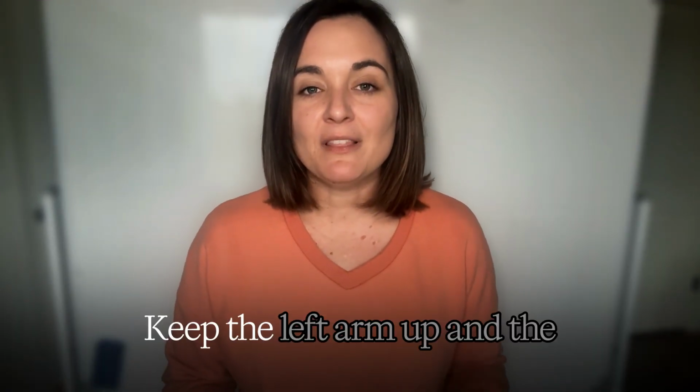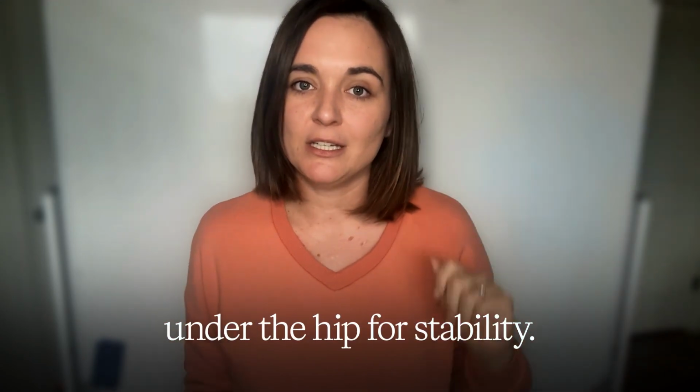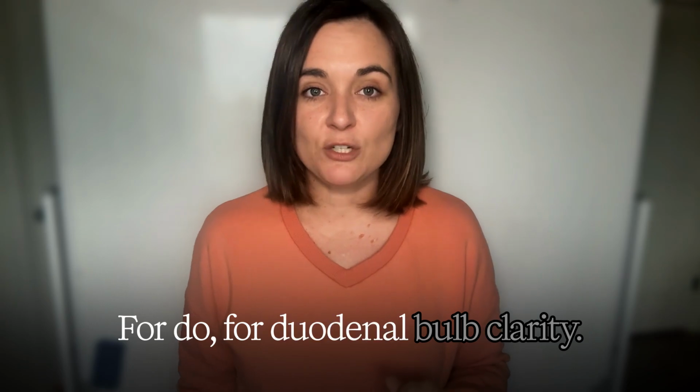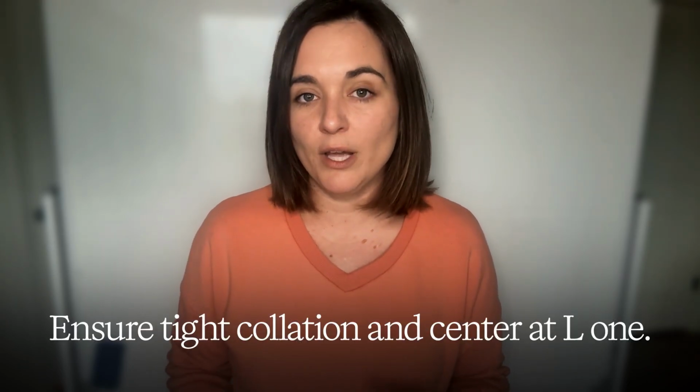Tip: an RAO. Keep the left arm up and the right arm down with a pillow under the hip for stability. For duodenal bulb clarity, ensure tight collimation and center at L1.